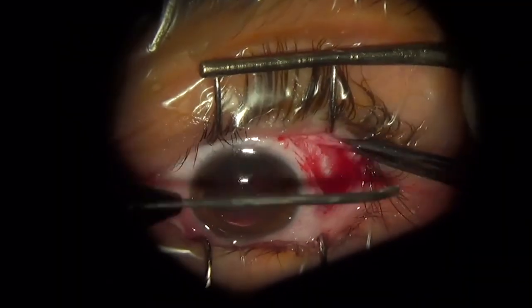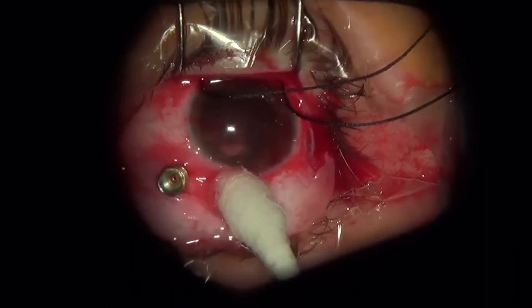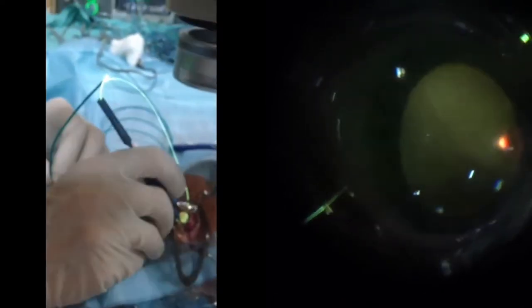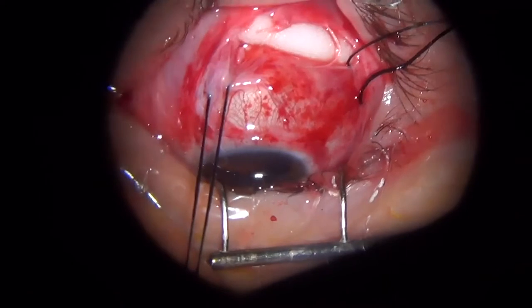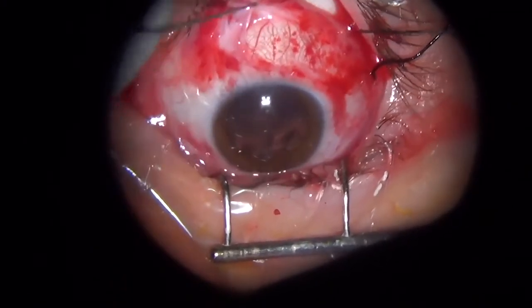So you see the opening of the conjunctiva. The subtenon block, I usually do in two quadrants, upper and inner. So I introduce a 27 gauge Oshima dual port. And this is the view from the outside. I handle the instrument with another light, and I start to indent with a depressor. And you see the point of the indentation. This is the squeezing moment when you want to put a mark, and the mark is very distinct. You can use a minimal buckle only in the place where you need it, and the surgery is done. The patient will not feel much pain. In this case, there was air endotamponade as well.